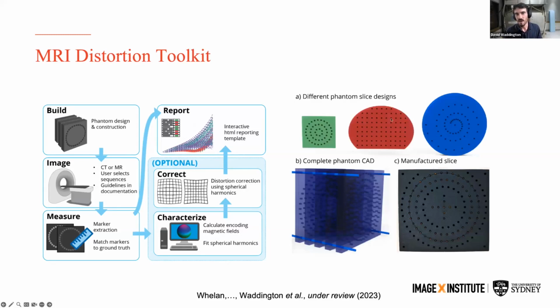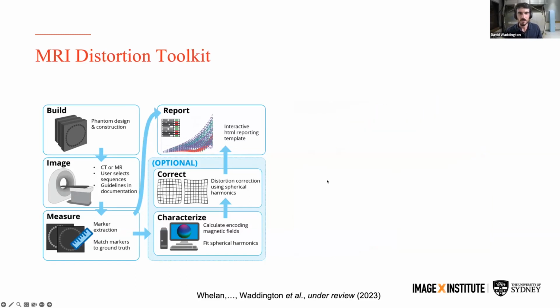There are a bunch of suggestions on how to do this, but it enables you to create production files to send to a manufacturing company, in this case, for laser cut foam. And then into these holes, you insert fish oil tablets or paintball ammunition. And that allows you to create this array for imaging, and then you image it.